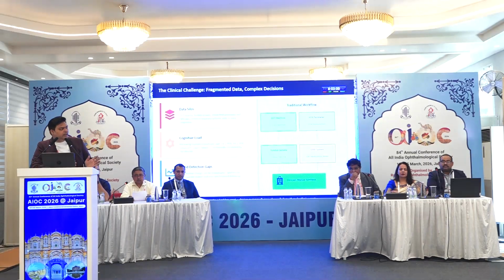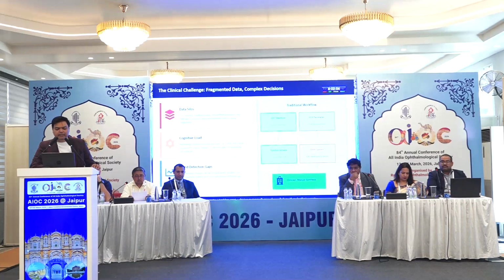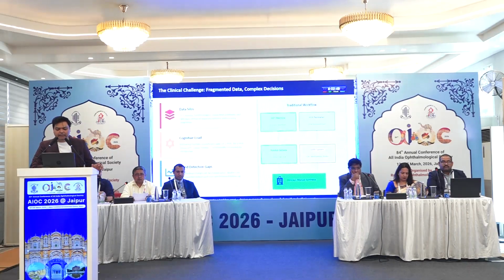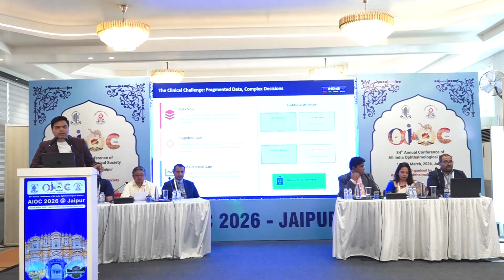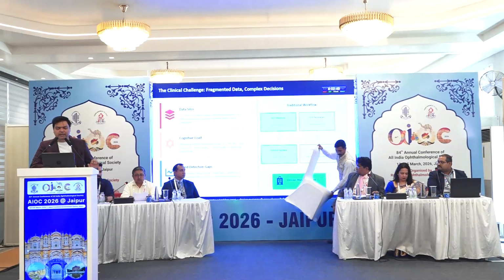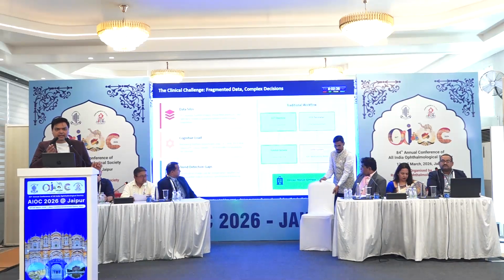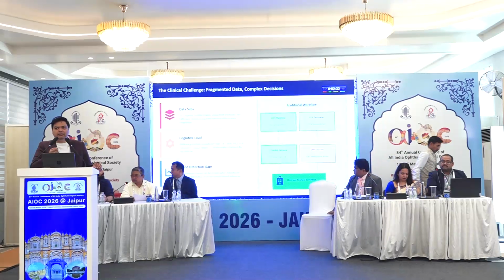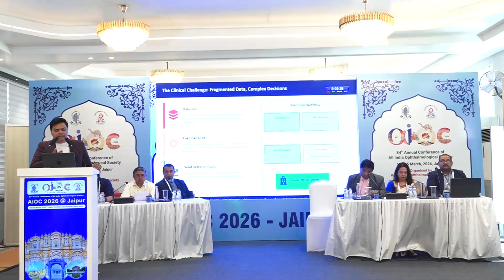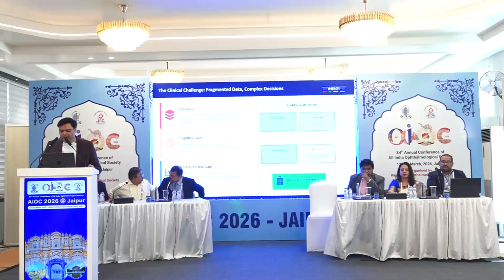So what the systems create is a data silo. They will have a silo of OCT reports, a silo of fundus images from the fundus camera, visual field interpretation coming from perimetry, and your own EMR data. If you want to connect to that, it can be connected in the same system. I do it in my same OPD desktop. Everything comes to my desktop, and that gives me more chair time to talk to the patient rather than analyzing those reports, because at a glance I can see, I'll show you the printouts. At a glance I can see those reports, and immediately I can tell that there is a structural functional correlation, you are a glaucoma person, or you are going to progress into that.